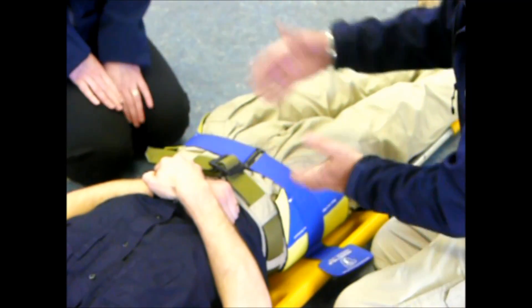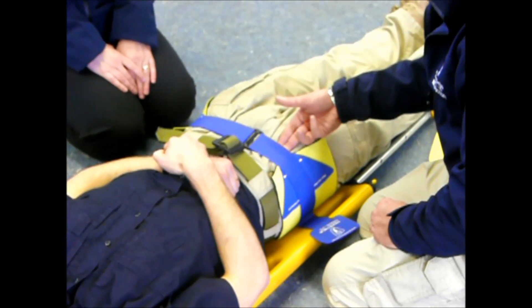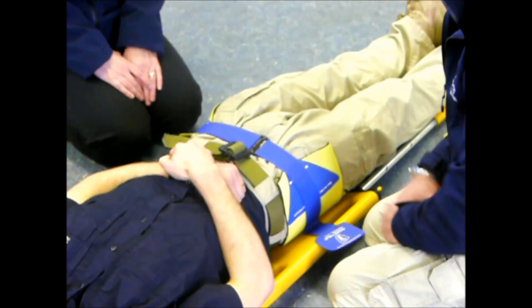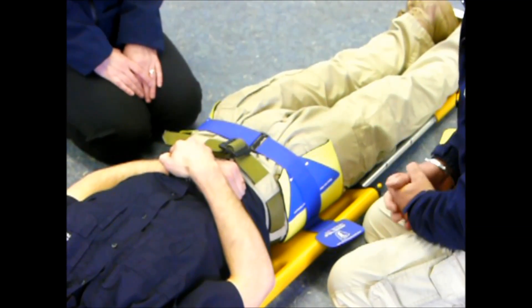You will either see the anatomy normalise enough to come back round, or you'll feel that you have enough tension to ensure stabilisation of the pelvic ring. As you can see, we have now exposed the groin area, so if there's a need to access the femoral area or for catheterisation, that can be done. The patient is now ready for packaging.